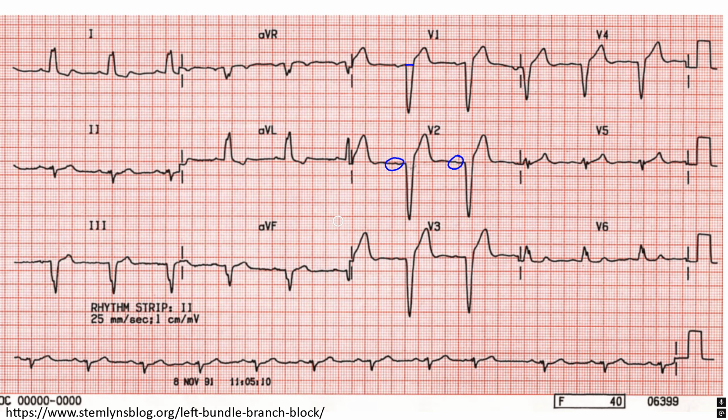So here are my rules. Number 1, is the QRS greater than 120, and is there a P or a pacer spike before every QRS? If the answer is yes, then look at the precordial leads. If they're down in the precordial leads, it's like you're pushing your turn signal down to turn left in your car, and it's a left bundle branch block. If they're up, it's like you're pushing your turn signal up to turn right in your car. It's a right bundle branch block.